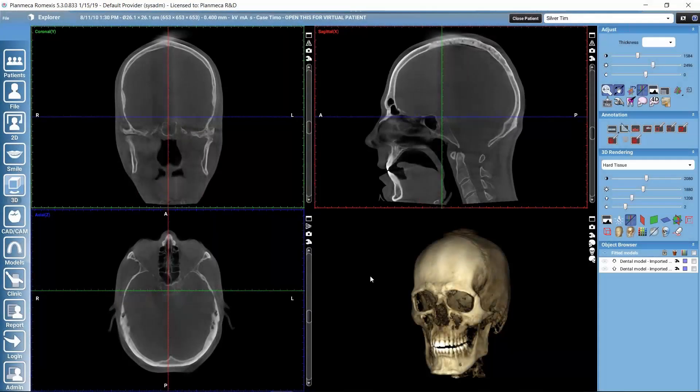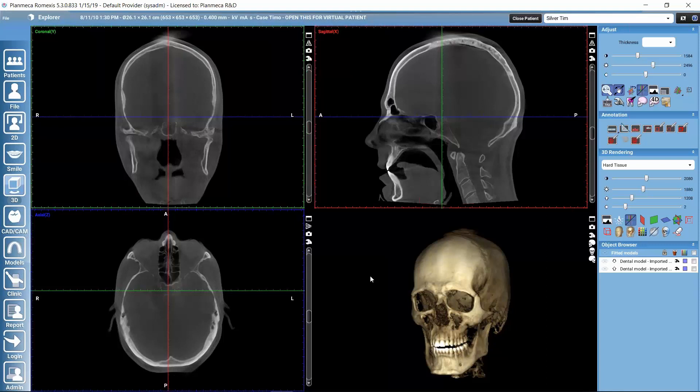In this tutorial, let's focus on the TMJ submodule here in the 3D imaging module of PlanMegaRomexit software. TMJ submodule is a special 3D submodule meant for analyzing the temporomandibular joint.